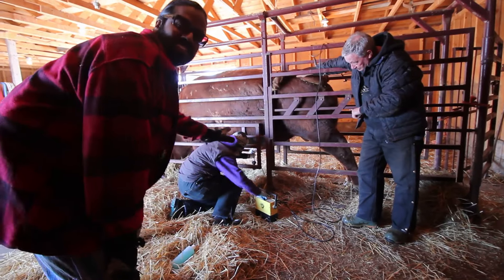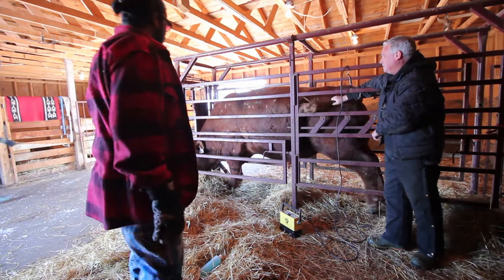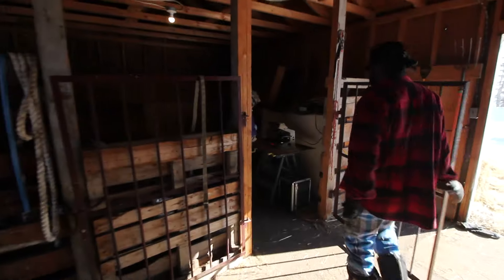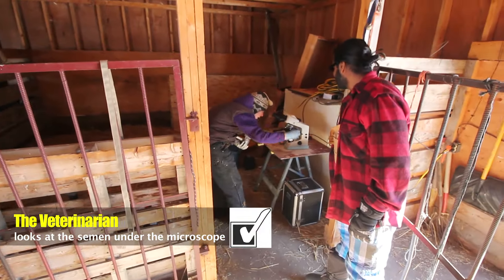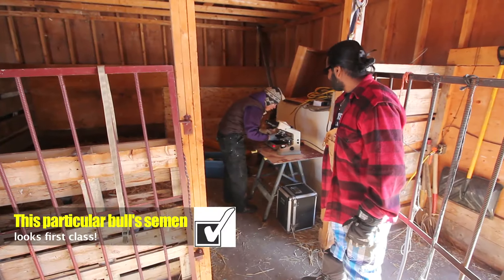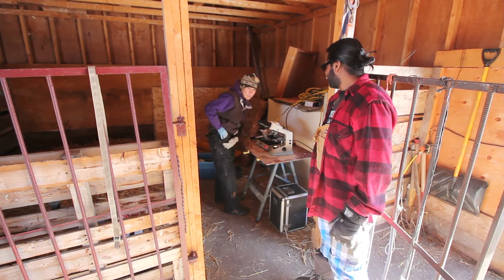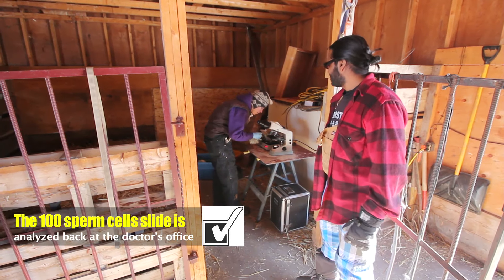Now it is collecting the sperm of the bull. It is finished ejaculating. We just need a small sample and then you look at a count under the microscope. We will look at a tiny drop under the microscope to assess motility — how well it is swimming. He looks very good. Then we put a drop of stain on the slide and a drop of semen, make a slide, and evaluate a hundred sperm cells under high magnification back at the office.